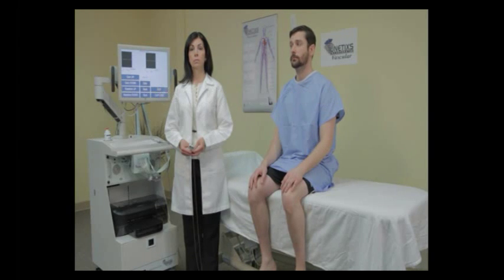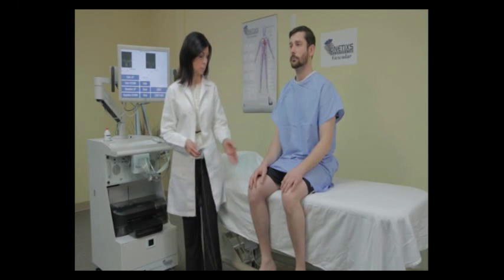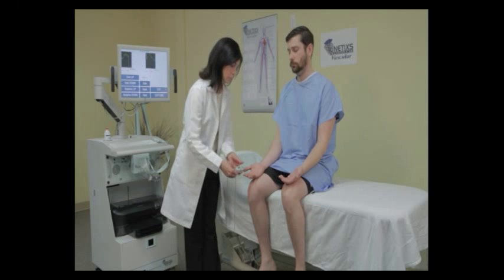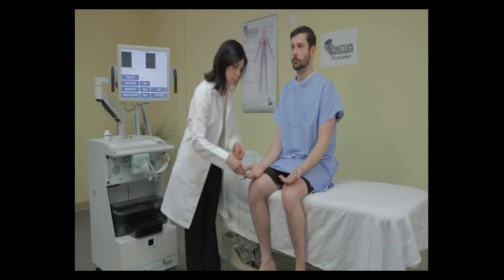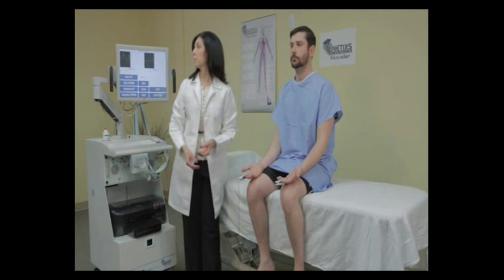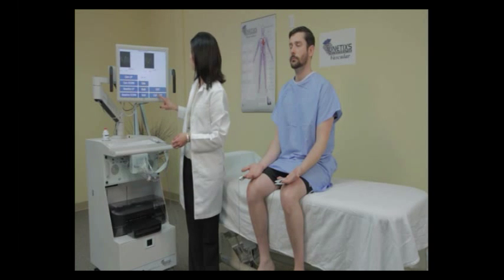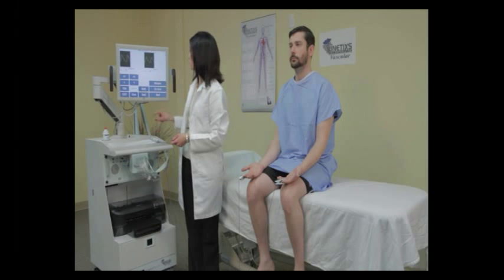In this video, we're going to demonstrate how to perform the thoracic outlet study. The patient is going to be seated for this examination, and we're going to take the PPG sensors and place them on the patient's fingertips with the palms facing up. You can use the index or the middle finger for this. We're going to adjust the gain on the screen to make sure the waveform fits, then wait until we see consistent waveforms, press the capture button, and then press next.